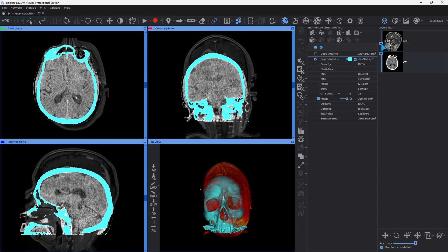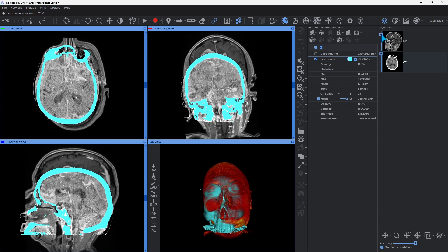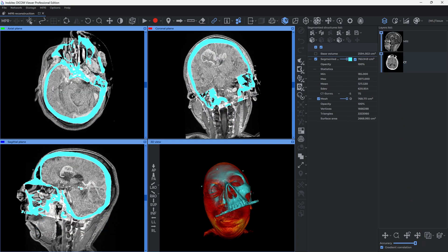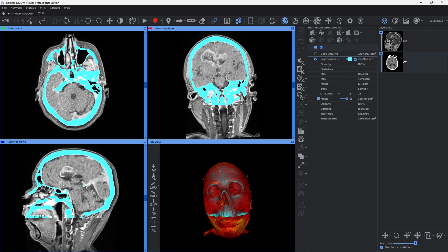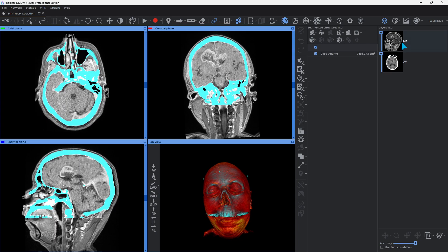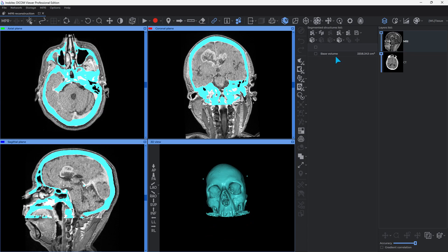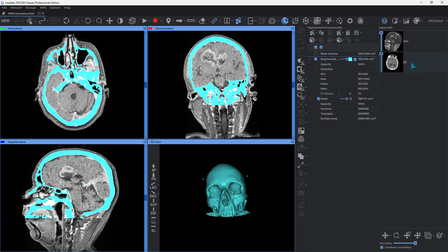Previously, transparency of the fused layers could only be changed for the base volume. Visibility, settings, and work with the structures were adjusted separately for each layer of the fused series.